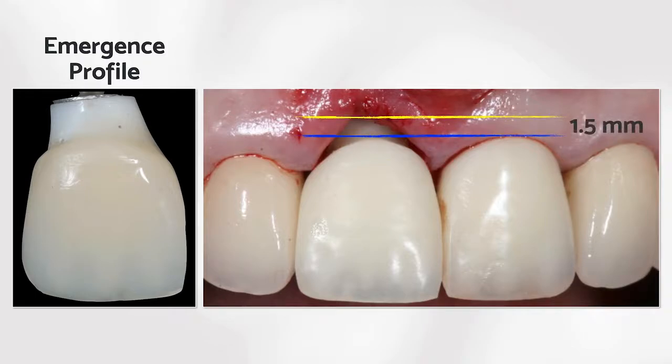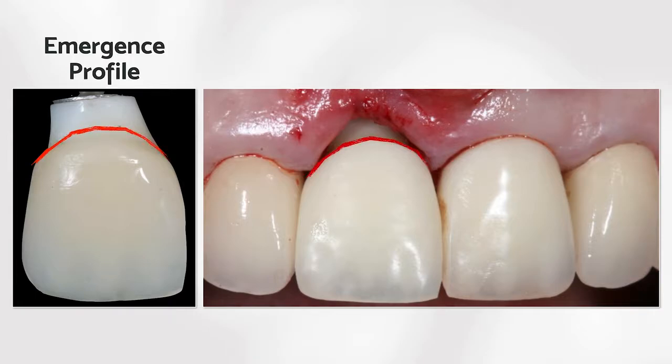And we have a gingival recession around 1.5 millimeters in height. But the finishing line of this provisional restoration was placed at the same level of the gingival margin of the contralateral side, regardless of the gingival recession. We left here what we call a soft tissue gap to promote a soft tissue accommodation in the coronal direction.